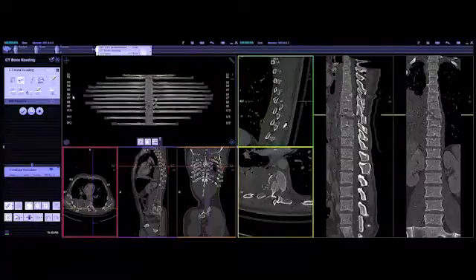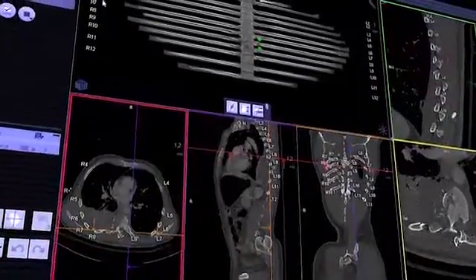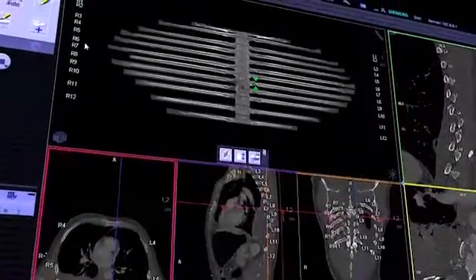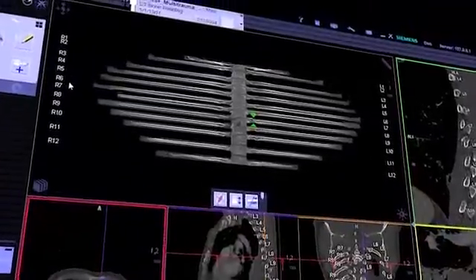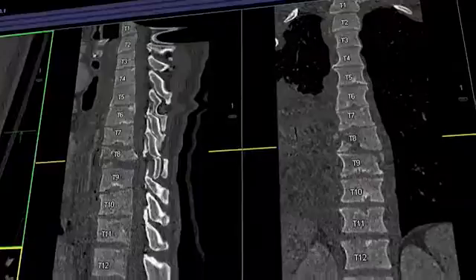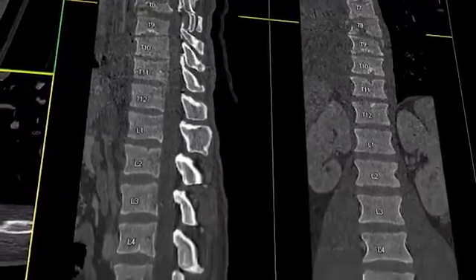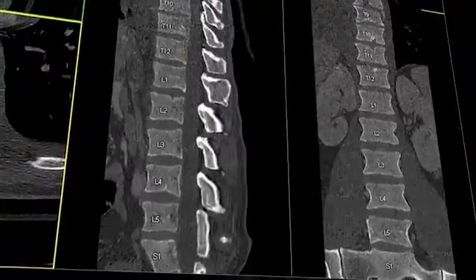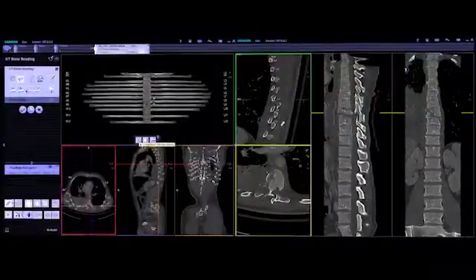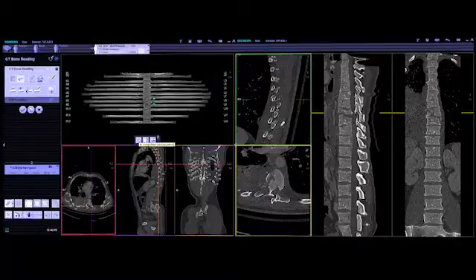Due to the automatic preprocessing, the case is ready to review when opened. The application has identified and labeled the ribs and displays the entire rib cage rolled on a 2D planar reformat. In addition, the vertebral bodies are labeled and the spine is presented in a stretched view for a straightforward overview of the anatomy. The dual monitor capability of Syngo Via provides you with a comprehensive and simultaneous overview of both the ribs and the spine.